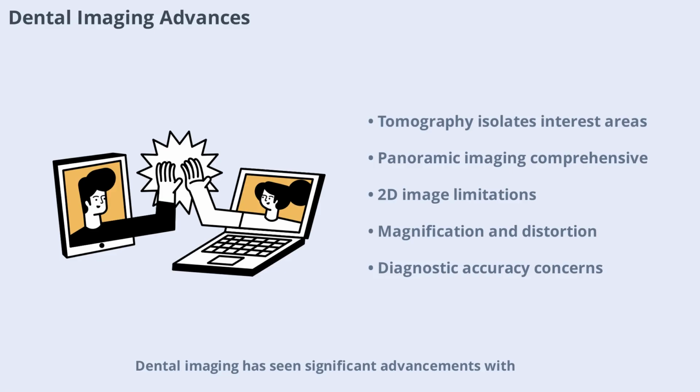Dental imaging has seen significant advancements with the introduction of tomography and panoramic imaging. Tomography isolates areas of interest, while panoramic imaging provides comprehensive views of maxillofacial structures. However, 2D images have inherent limitations such as magnification, distortion, and superimposition, which can affect diagnostic accuracy.